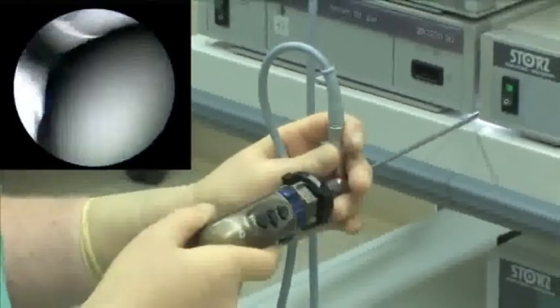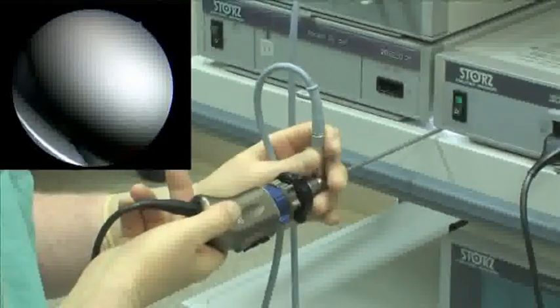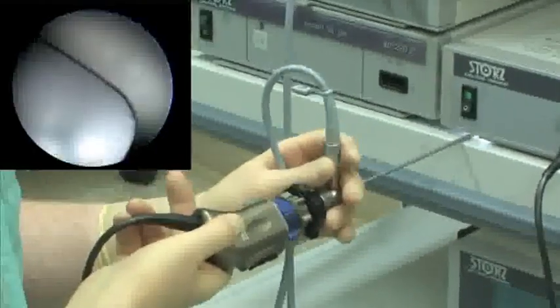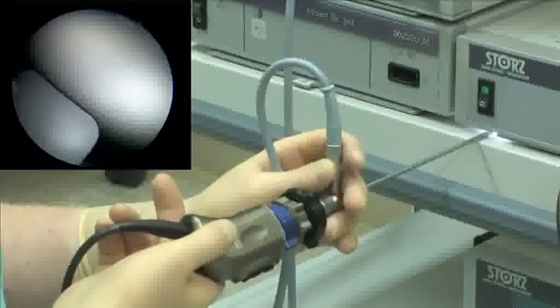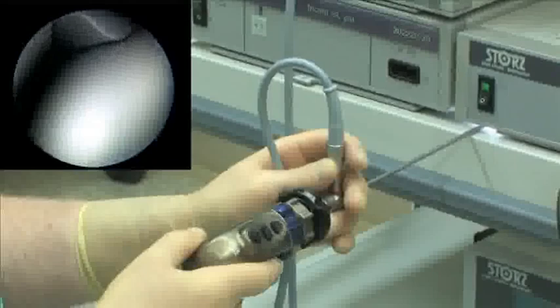Turning the camera, orientation is totally lost. We do not know where we are. Retracting the endoscope does not provide any additional information, and only the correct camera alignment is helpful.